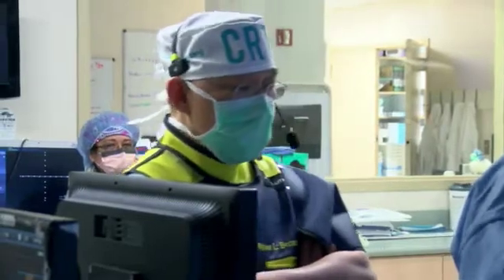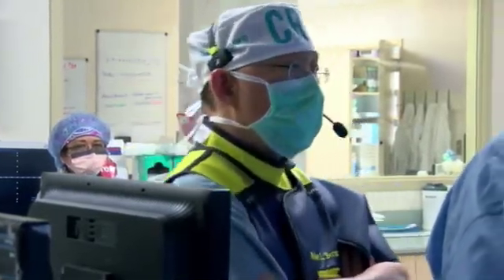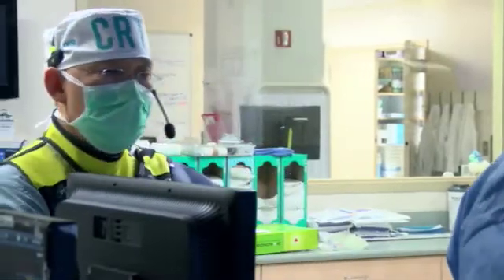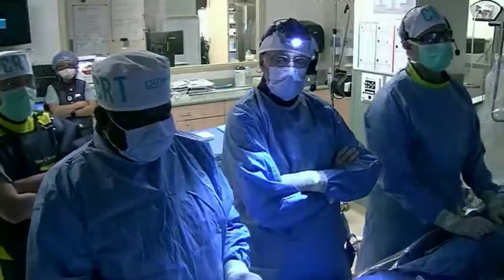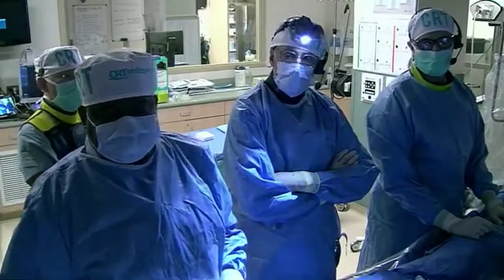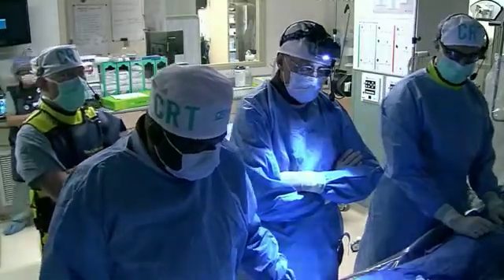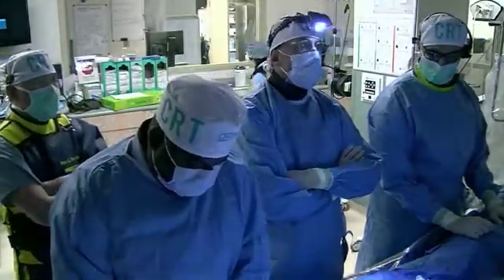So we have Dean Kyriakis, he's the PI of the CAD trial, and you've seen probably a lot of those cases as they entered, and there was also an OCT subset. Would you say that this is a suitable case for shockwave, Dean? If you can unmute. Ron, I don't think there's any downside to it, to be honest with you.